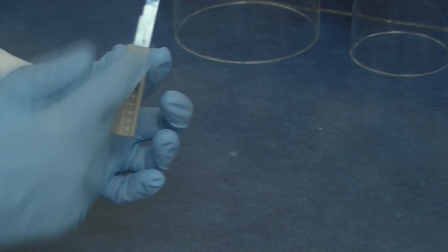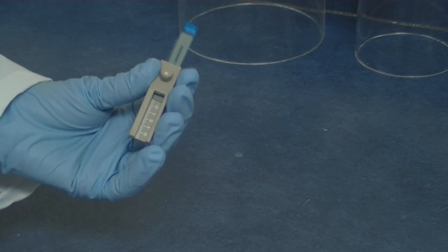Now you are ready to send the bite fork along with your models and prescription to the laboratory.